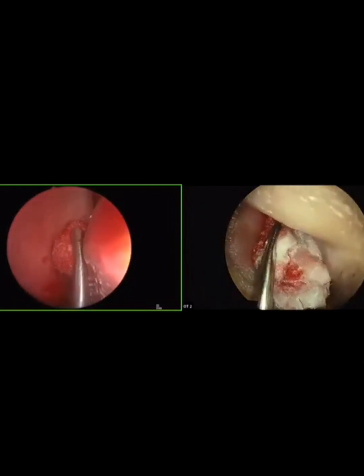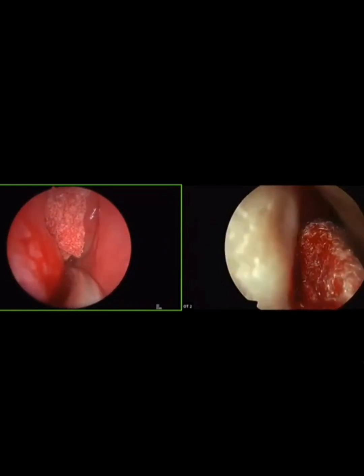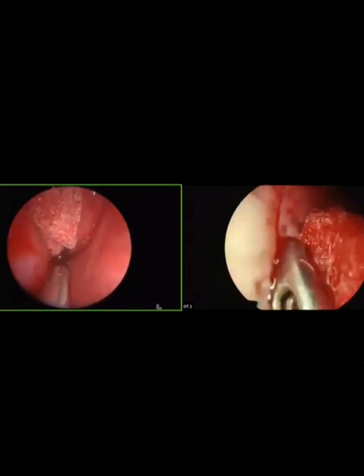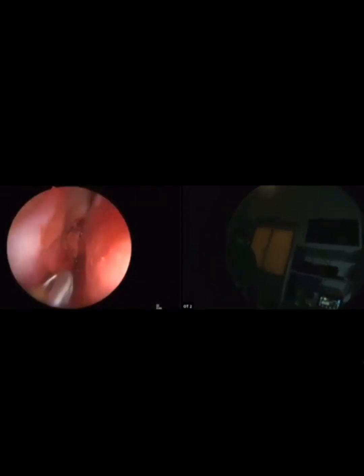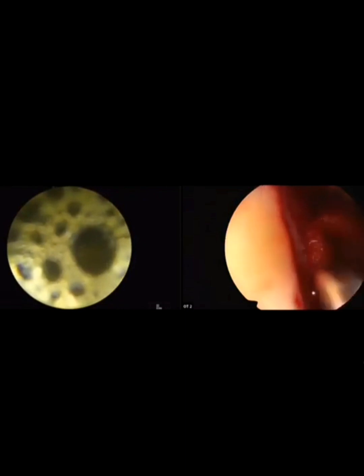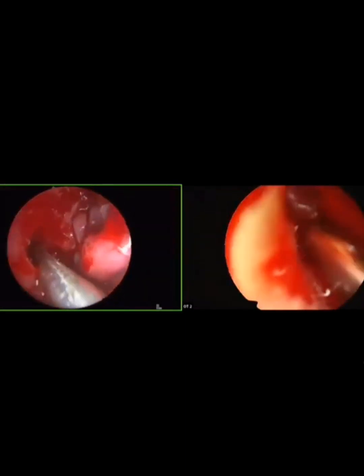Sir, in case of mega antrostomy, sometimes patient feels pain while breathing because of excessive air. Yes. Okay. So no need for mega antrostomy in this patient, I think. Sometimes patient complains of mucus plugging, mucus coming out in the throat and always complaining something coming in the postnasal space. Have you ever seen this in patients of mega antrostomy in follow-up? Lot of mucus coming in the postnasal space, no? Postnasal drip. Yes. That is the problem with mega antrostomy.